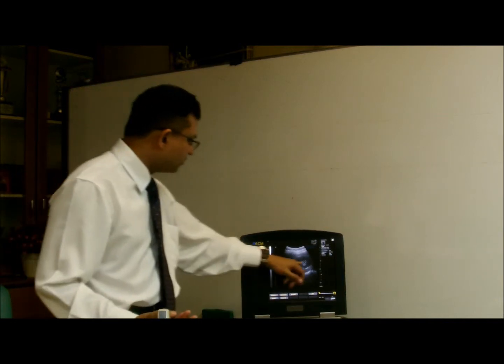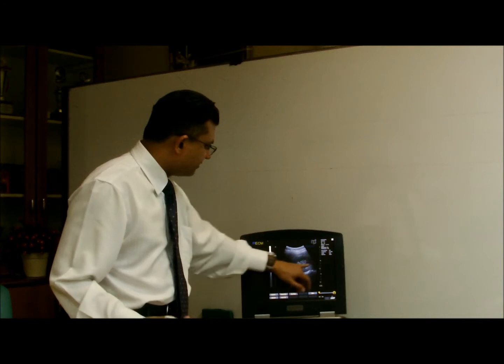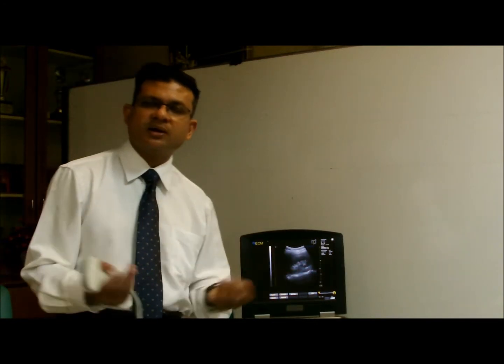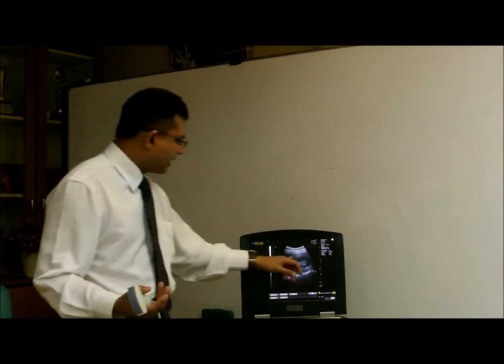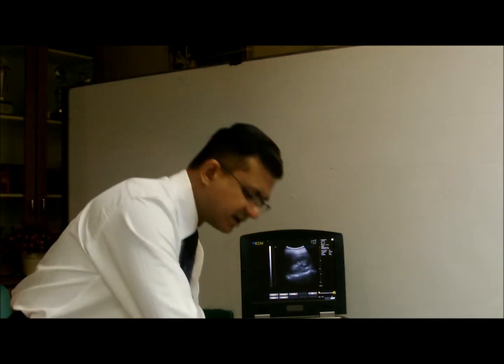You also want to look whether there is any hydronephrosis, whereby over the medulla area you will find hypoechoic presentation, and you could differentiate that from vessels by looking at the colour Doppler. Now this is over the right kidney.